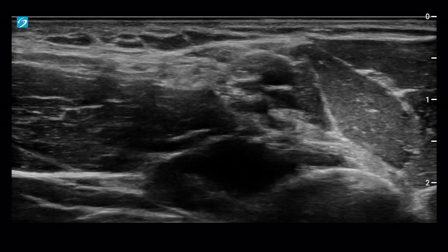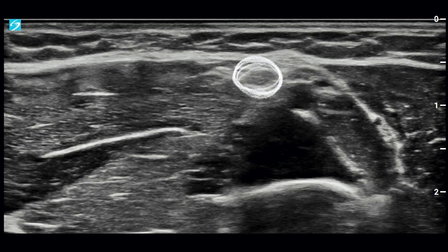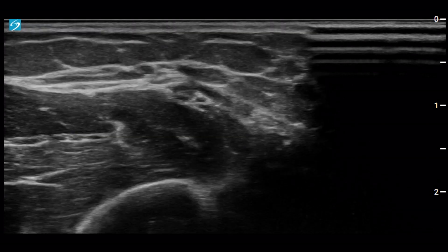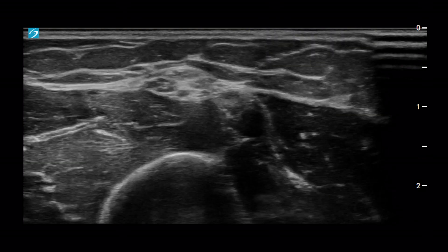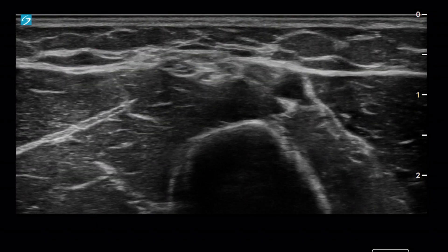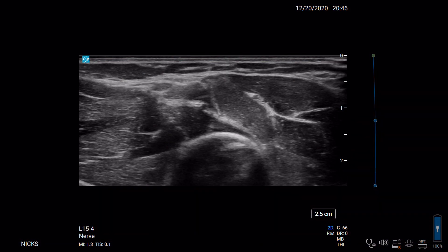Just beyond that further to the left is the ulnar nerve. If I spread the gel around and scan down, the median nerve has flipped over the top and the ulnar nerve is now at about 10 o'clock. Scanning further down, the ulnar nerve is stuck right on top of the muscle — scanning pretty far down, beyond halfway down the upper arm. The ulnar nerve is just sitting on top of the tricep. Scanning back up, the median is actually staying with the artery all the way down to the elbow, and the ulnar is coming back to join it. There's also a nice shot of the radial nerve just coming up underneath.